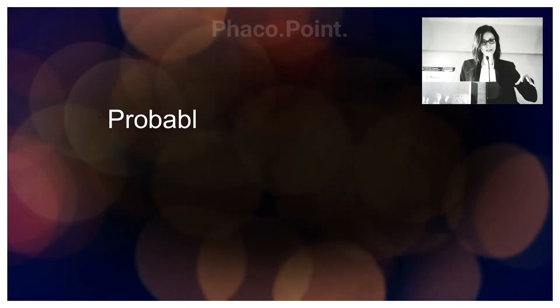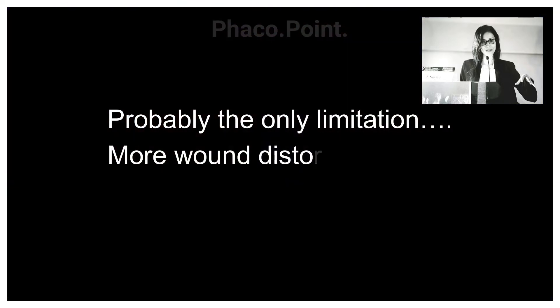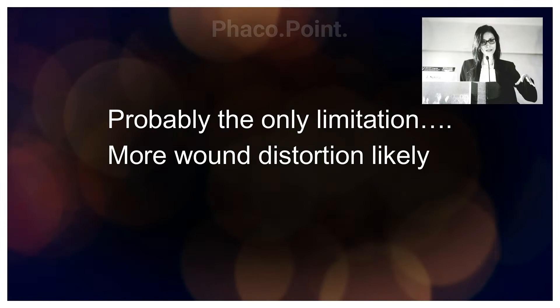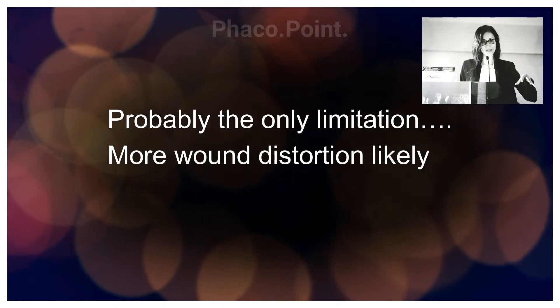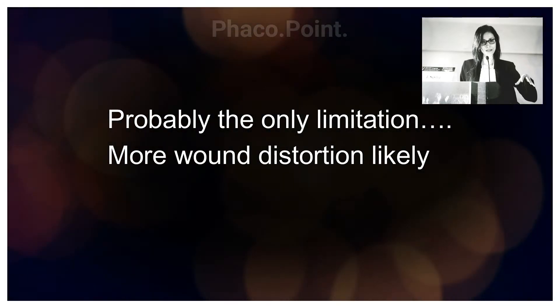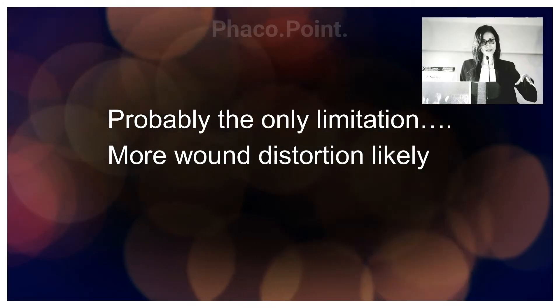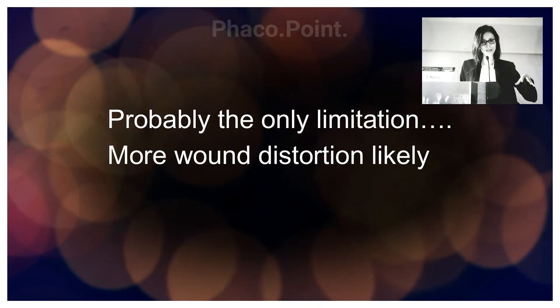The only limitation of semi-section of the IOL is that you're yanking it across a wound, which may cause some damage to the wound itself. I therefore ensure that I enlarge my incision from the conventional 2.8 to almost 3.2 to 3.4 to 3.6 millimeters to allow for ease of removal of the IOL.